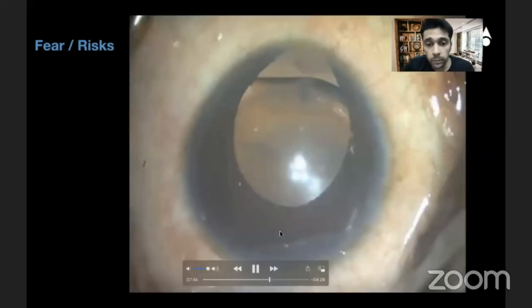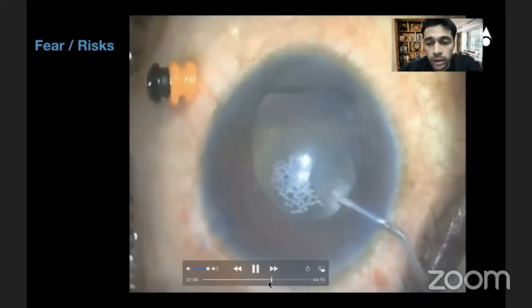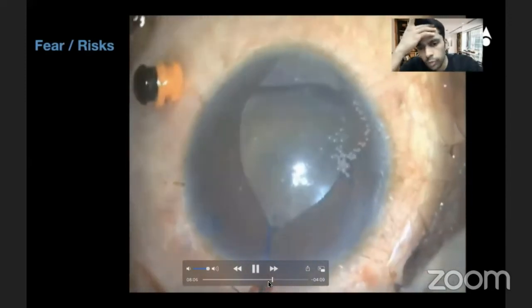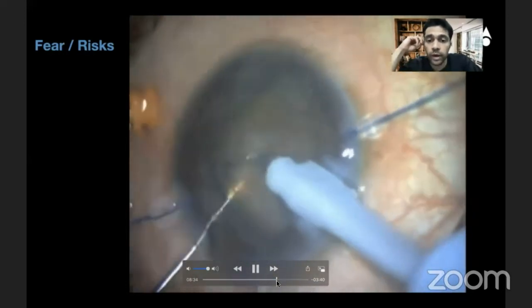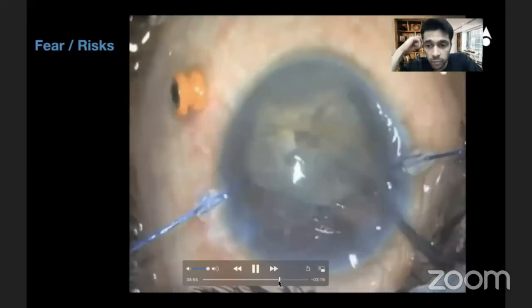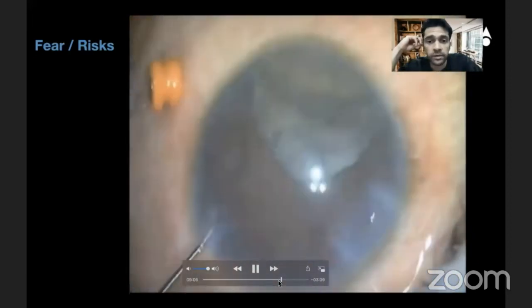Sometimes you want to use capsular hooks — specifically when the coloboma is large. I want to show this case because this is vitrectomy-assisted FACO going wrong, and I learned a lot from it. Here I'm putting my iris hooks in place. In hindsight, I might not have done that — I probably should have waited for the FACO to proceed differently. The nucleus is trying to go down; I'm trying to manipulate it, bring it into the anterior chamber, remove the iris hooks, and then complete FACO emulsification. I push in some viscoelastic on the side but it was still going south.